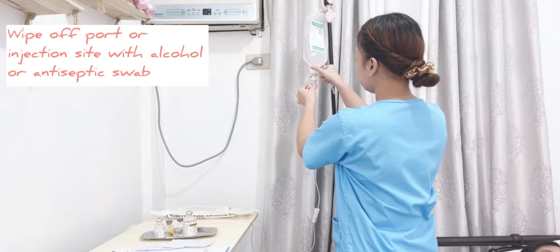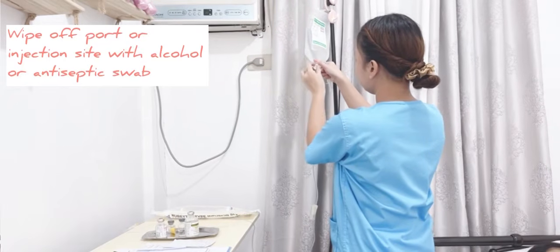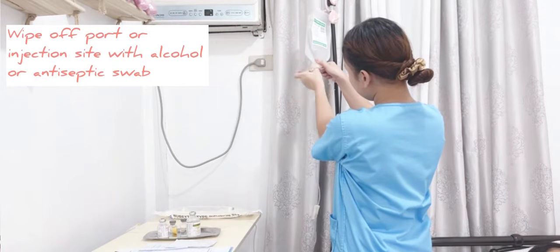Then wipe off port or injection site with alcohol or antiseptic swab. It reduces risk of introducing microorganisms into bag using needle insertion.